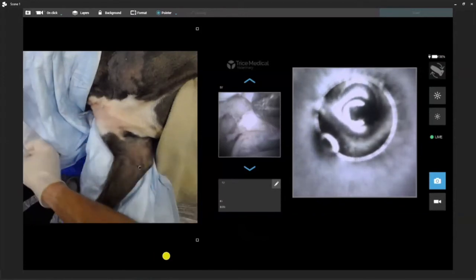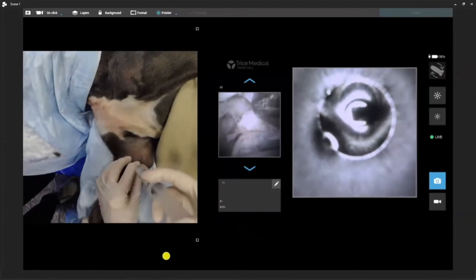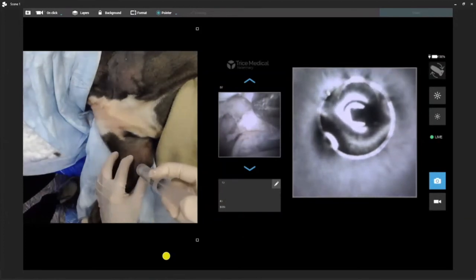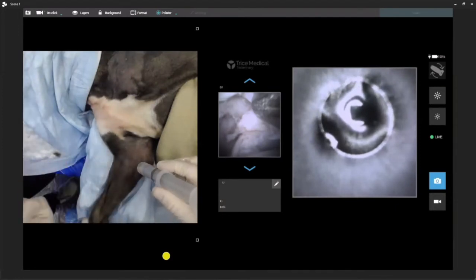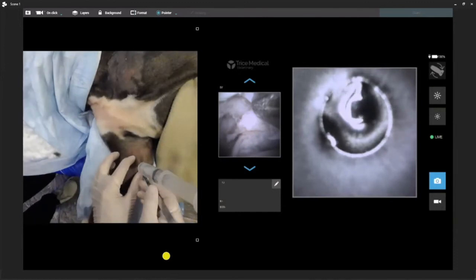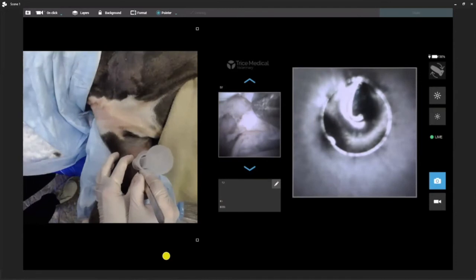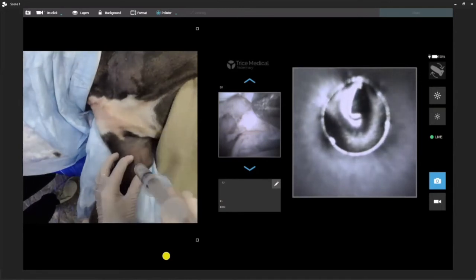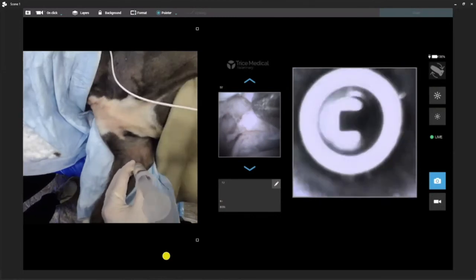We'll take our saline or LRS, whatever you're using. Not as much fluid here — about 5mL, just enough to distend it. Much less than you need for the shoulder. Once again, our 15 blade — just a little stab into the skin. I'm not a big fan of going all the way into the joint with the blade. I don't want to lose all my fluid. I want to keep the capsule nice and tight.